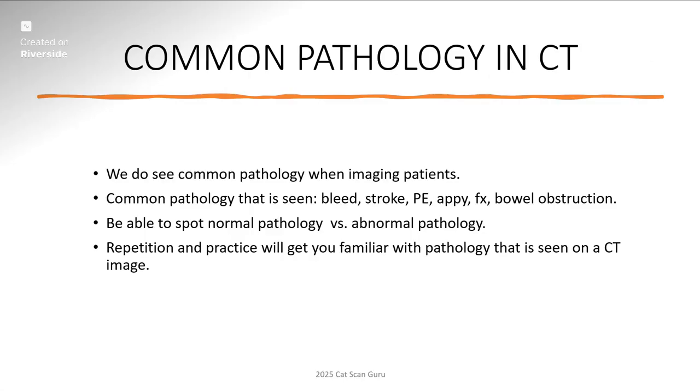This is just to give you a general consensus. Repetition and practice will get you familiar with pathology seen on CT images, just like I stressed before. Reading the radiology reports on scans you did, saying, hey, this doesn't look right, or even talking to the radiologist and asking them, are really good tools and resources for that.